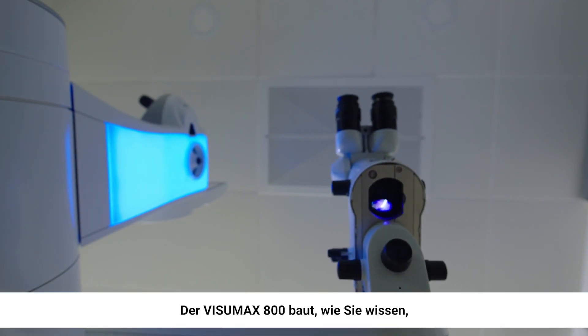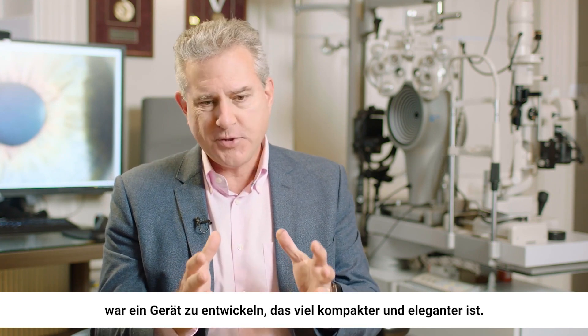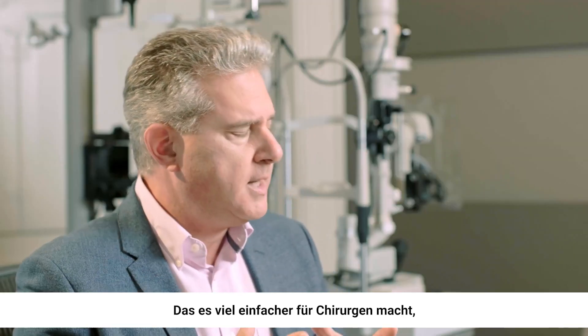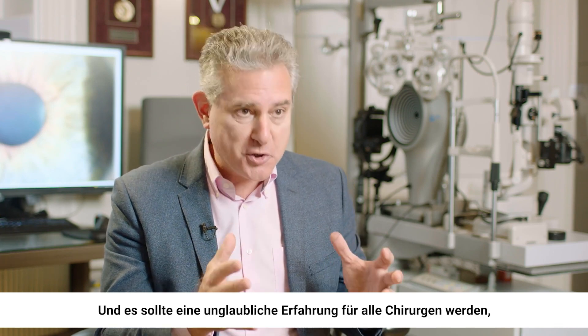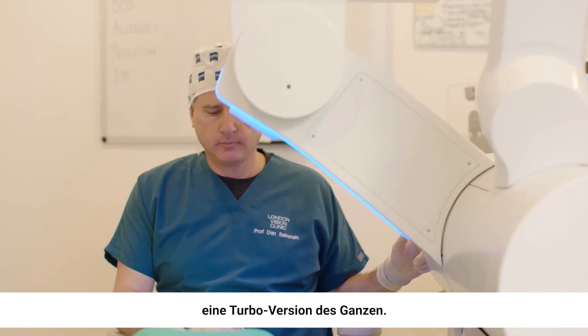The VizuMax 800 built on the experience of the VizuMax 500. What we tried to do with the 800 was to make a device that was a lot more streamlined, that was going to be easier for the surgeons who hadn't yet done SMILE to start SMILE. And it was going to be like a supercharged experience for those surgeons who had done thousands of eyes on the VizuMax 500 — a turbo version of the whole thing.